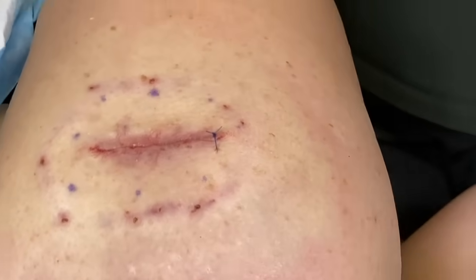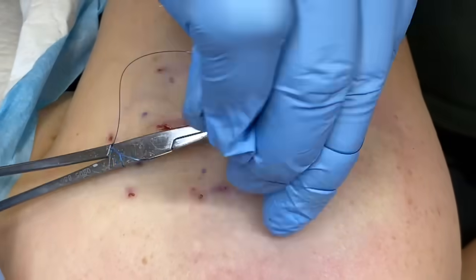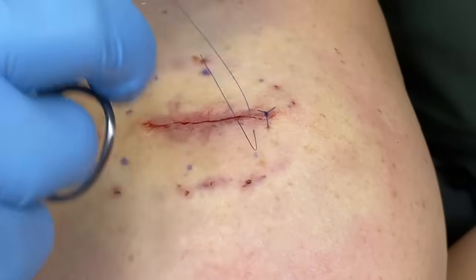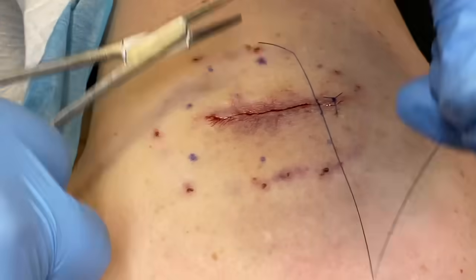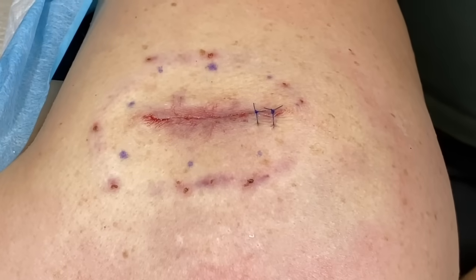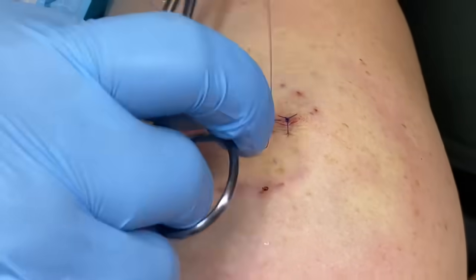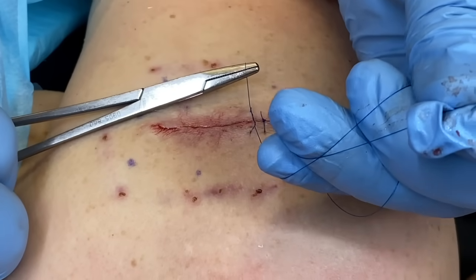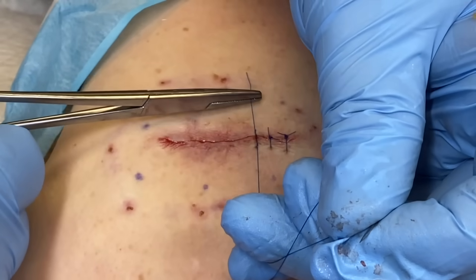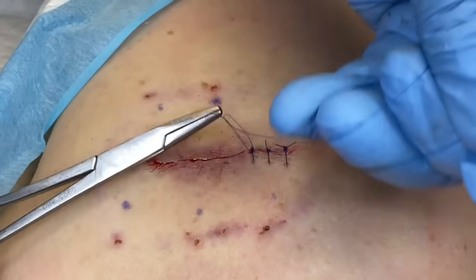And you're still comfortable? Yep. See, it's caught on my instrument, so I have to just release that. Just let it go, pull it apart, and do it again. So again, see how that's laying like that? If I do it like this, that's the improper way. This just makes sure that you have even pressure across the incision, which will lead to better surgical results at the end of the day. So you have less buckling, more direct apposition of the basement membrane.